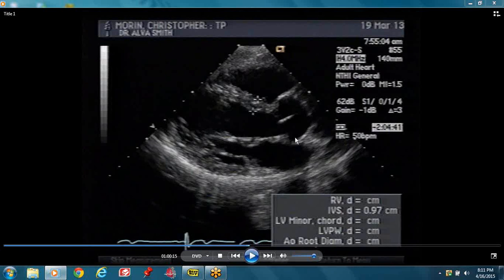The parasternal long axis shows the right ventricular outflow tract, septum, posterior wall, posterior mitral leaflet, anterior mitral leaflet, left atrium, aortic valve closed, and the aorta going up. This is your descending aorta right there.